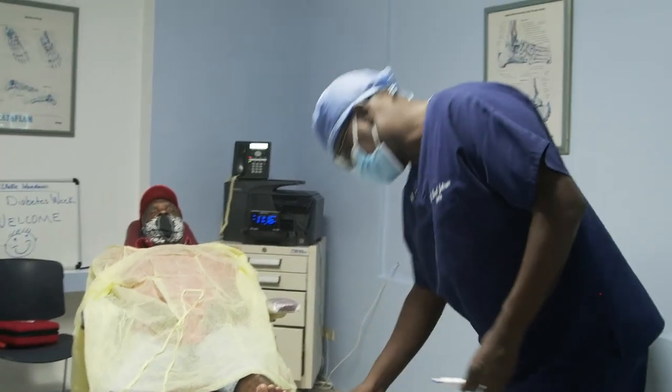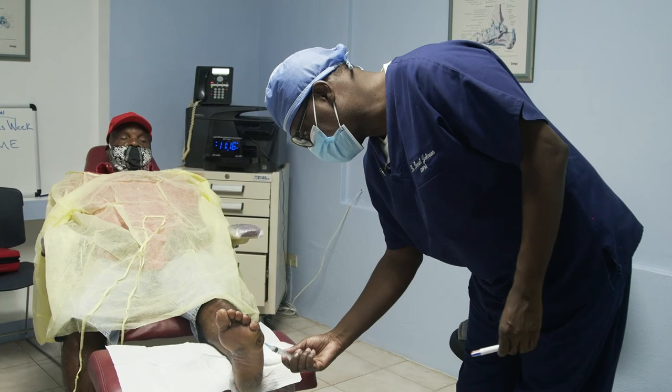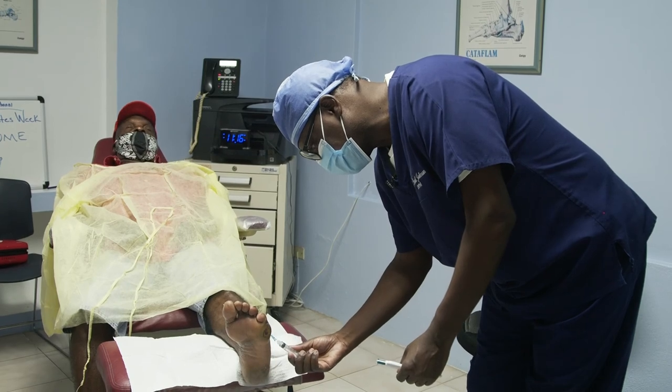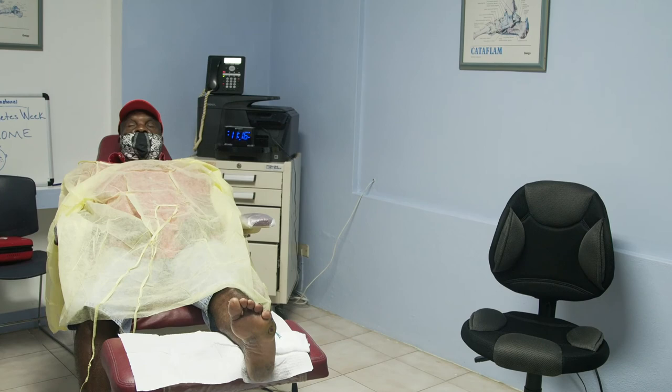Okay. So we take this out now. So that's my spot where I did that incision. So now I'm going to just take this right away. And it comes right out. Okay, clean up. And we'll be right back. And we're out of there.